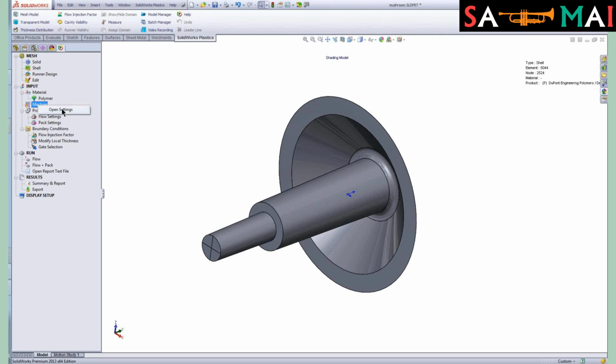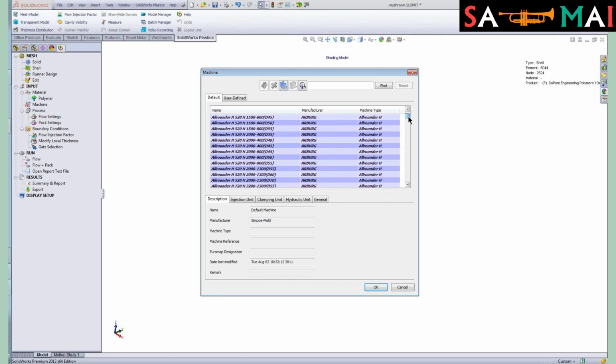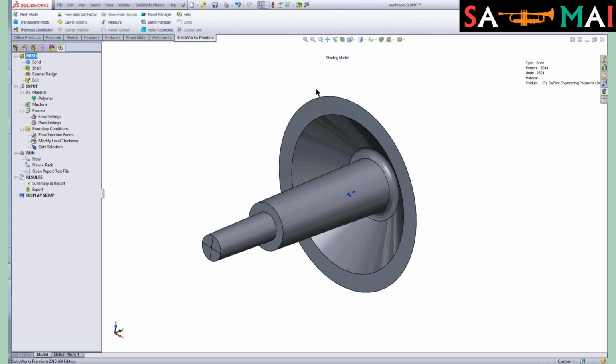Next thing that I need to do is open the settings for the injection mold machine. The default for Plastics Professional is just a single machine, but with Plastics Premium, you get this library of several hundred different manufacturers for injection mold machine settings. The biggest thing here that we're really looking at would be the maximum shot volume and maximum injection pressure for our mold machine. So we'll go ahead and choose the default machine, which, believe me, is more than adequate for this tiny part.